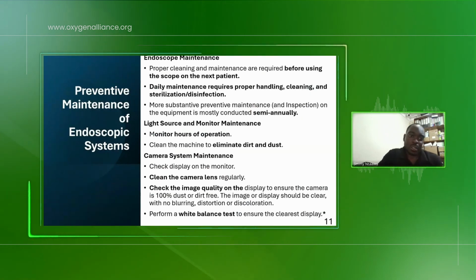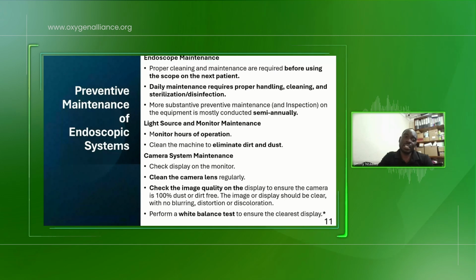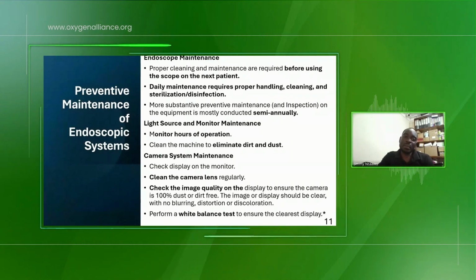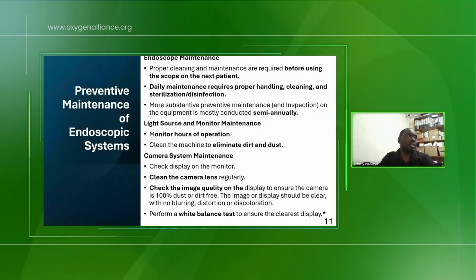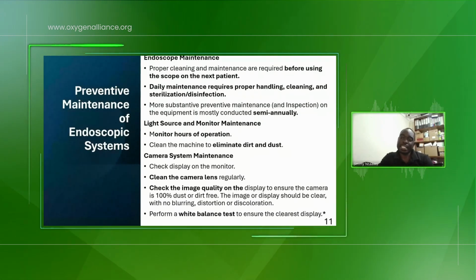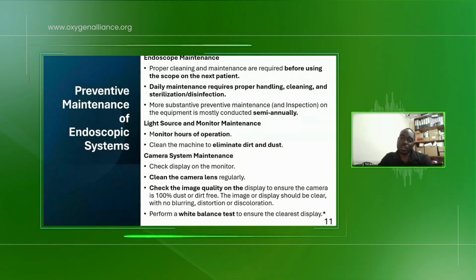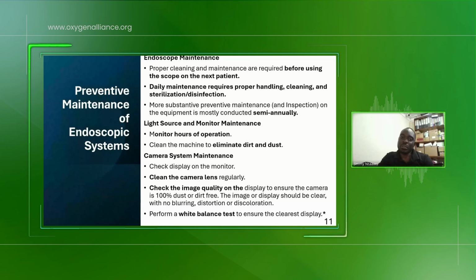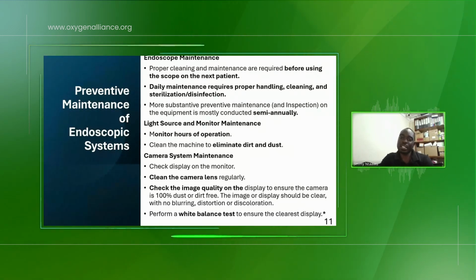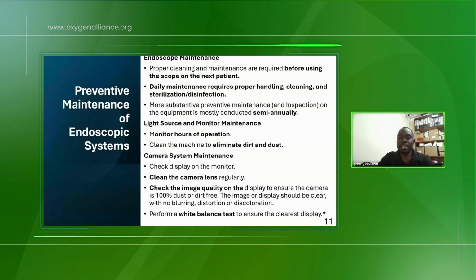Yeah, so let's go to the preventive maintenance. As we are doing this section, I want us to keep it in our mind that when it comes to flexible endoscopy, it's maintenance and handling of the scopes that we focus on majorly, because if your scopes are handled very well, they'll rarely break down and they'll last longer, they'll save you repair costs, and they'll keep patient safety and the user safe.